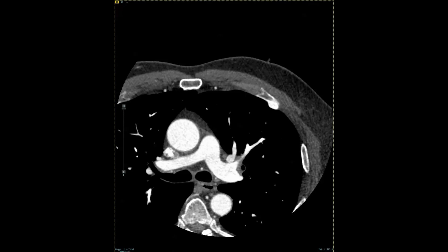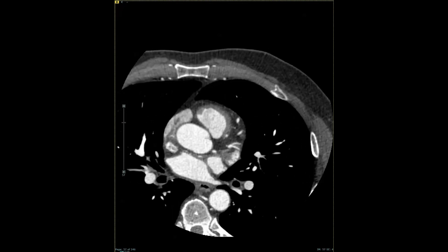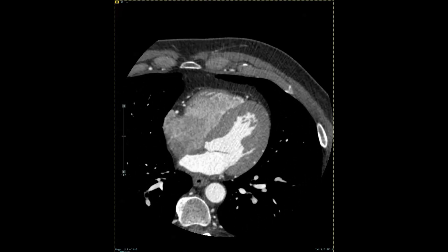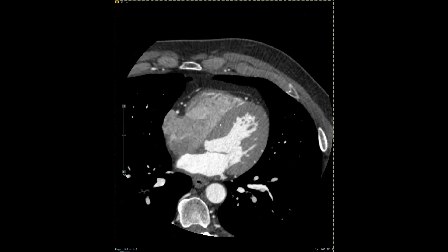These are axial images through the chest. To orient yourself, imagine that we are traveling through the patient from their head to feet, with the top part of the image being the patient's front and the bottom part of the image being the patient's back. We gave the IV contrast so we can see that there's bright highlighting of the blood pool, and from that we can see the structure of the heart.